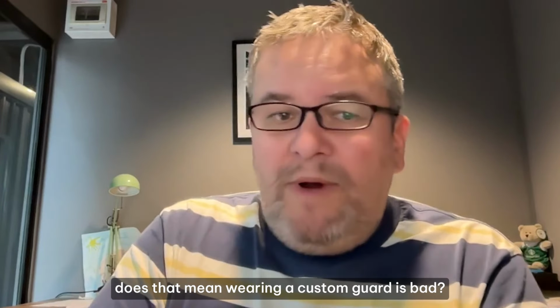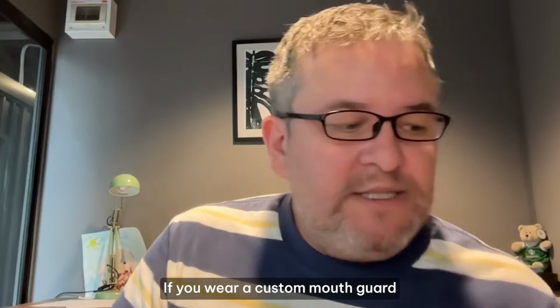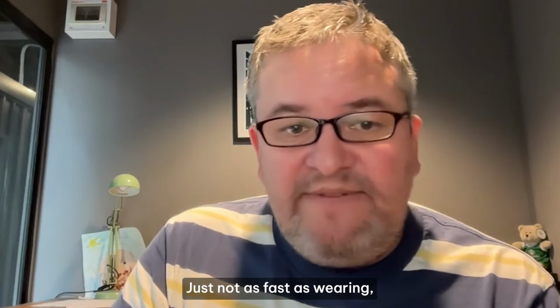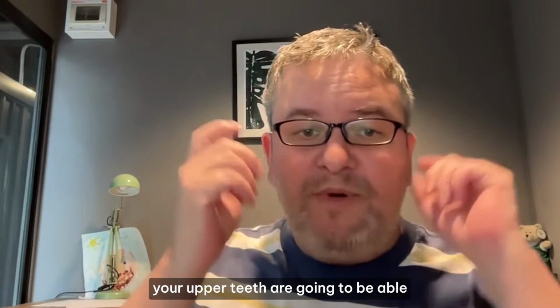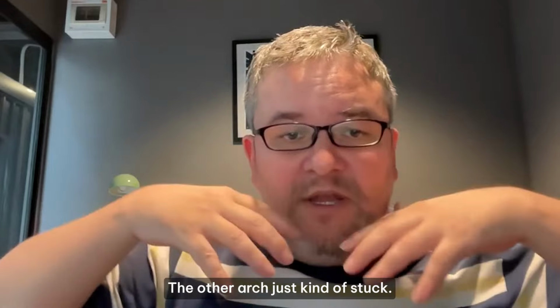And so that's something I feel pretty confident in saying, that a mouth guard will work faster than a lower splint. Does that mean wearing a custom mouth guard is bad? No. If you wear a custom mouth guard that is on your lower teeth and is flat, you're going to get better, just not as fast as wearing a Reviv or a Shock Doctor or something like this. So it still works, right? Your upper teeth are going to be able to expand and move. So one arch is able to move, the other arch is kind of stuck.